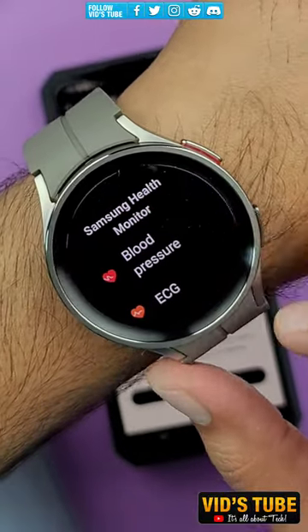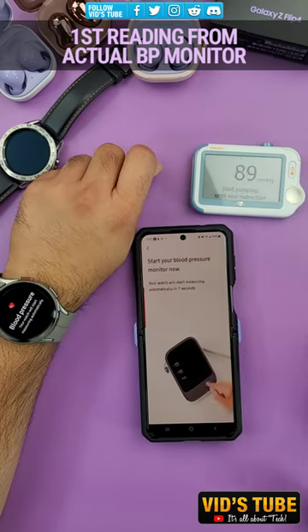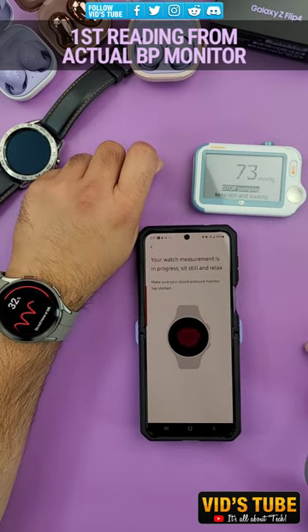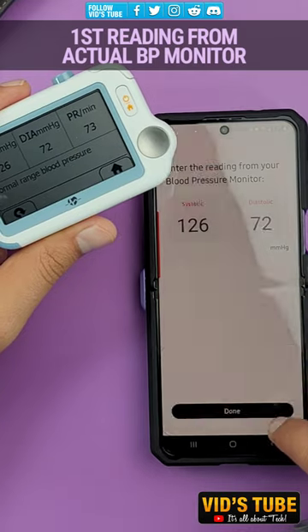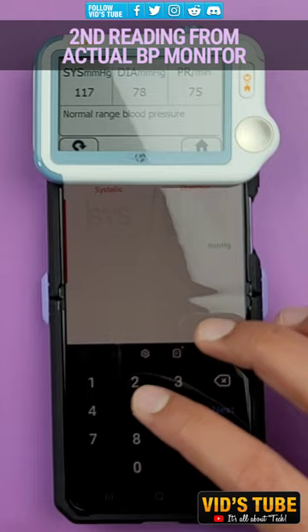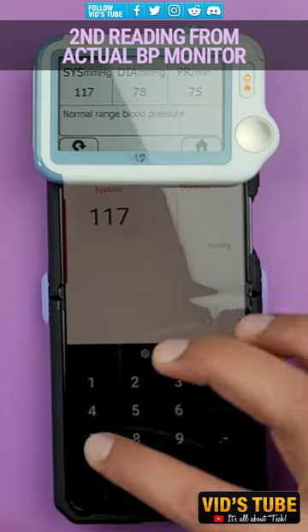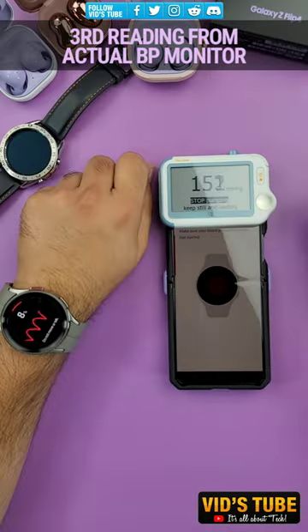This is how you can calibrate your latest Galaxy Watch 5 Pro for accurate blood pressure readings. From the Samsung Health Monitor app, you have to take and input three consecutive readings from an actual inflatable arm cuff blood pressure monitor, with the watch on the opposite side. After those three actual readings, the watch will automatically calibrate itself to the actual monitor for accurate readings.